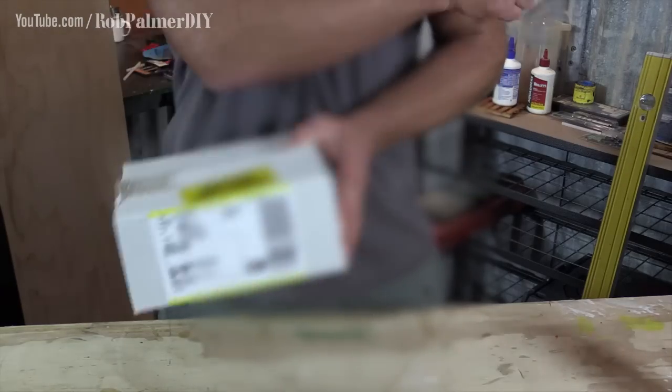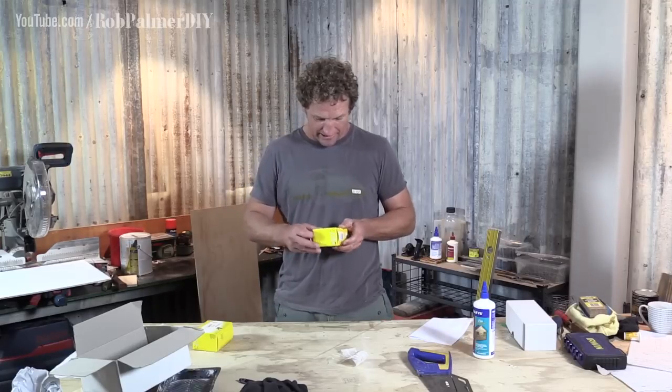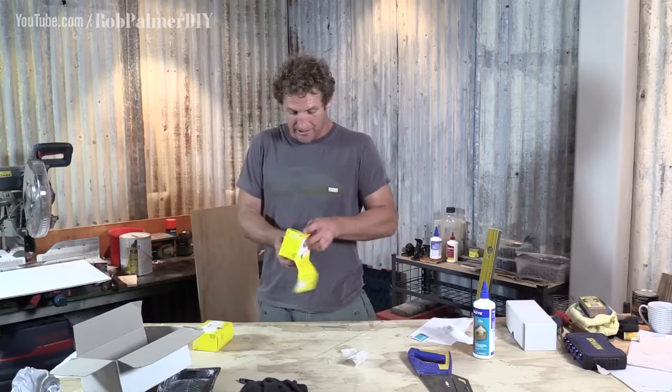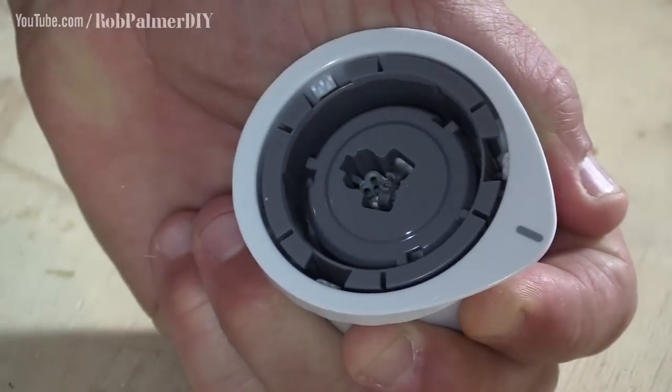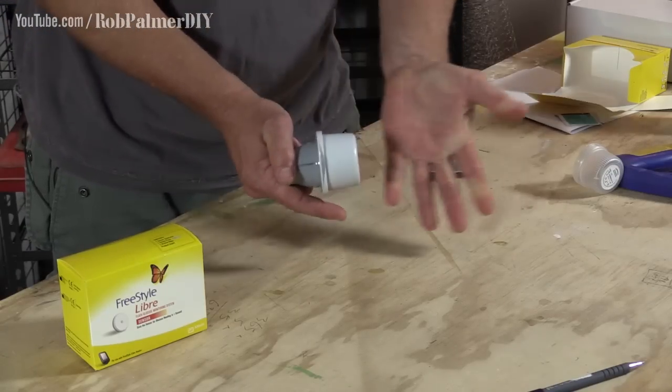Anyway, I'm going to open this thing up and get right into it. Oh, look at them — little sensors. I'm going to put it straight on my arm and we'll see how this goes. Basically, what's going to happen: the sensor's going to read my blood sugar all day, every day. You basically just open them up, load the sensor. Done. Cocked and loaded. Woo!